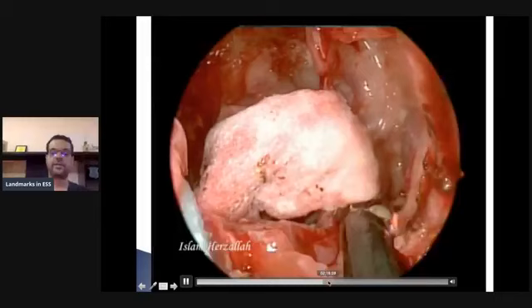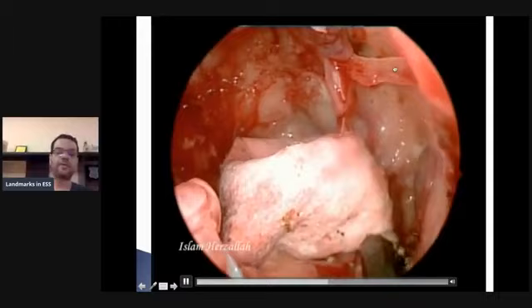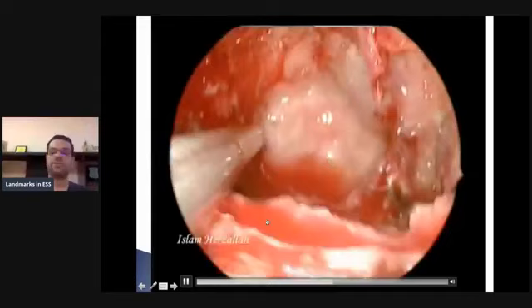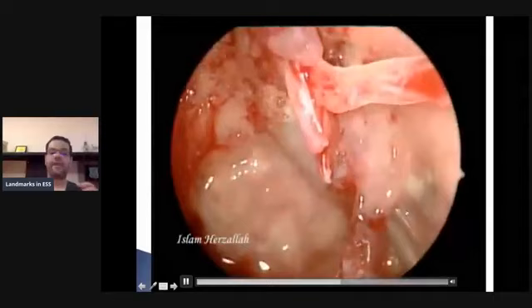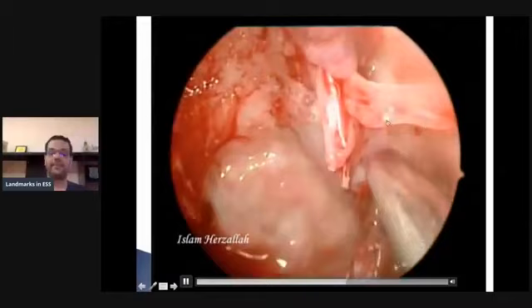And again, see, now I'm showing you. Can you see this band? Probably some of you will start. Can you imagine, you are inside the surgery, and you know this patient has perception of light only. She has severe deterioration of her vision. What exactly is this band in the middle of the field? You need to be very careful working around your landmarks, brainstorming what exactly this band is going to be. Well, I put all the scenarios of what this can be.